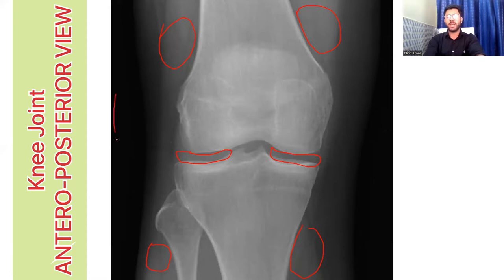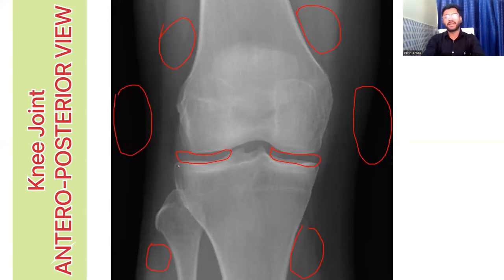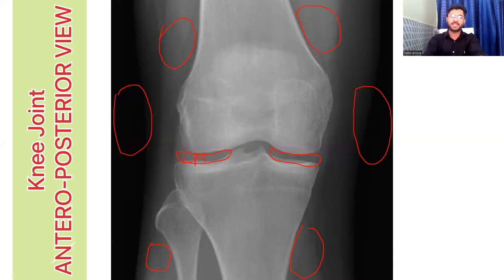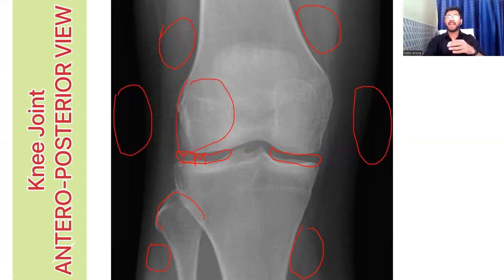This black area on both sides is air, because it does not absorb any x-rays. Now, how do you interpret which side of the x-ray you are looking at? I said this is the lateral meniscus, but how did I know? Because fibula is present on the lateral side of the knee. So the parts on this side will be the lateral epicondyle, lateral condyle, lateral meniscus and lateral tibial plateau.